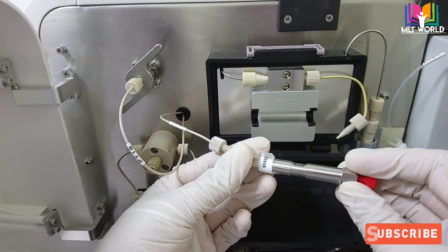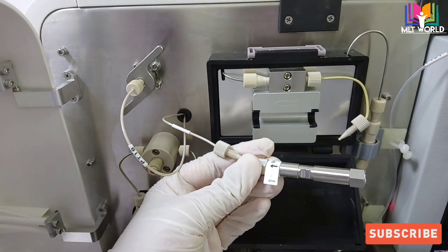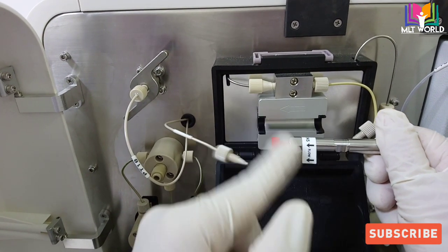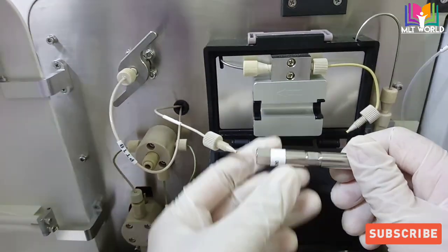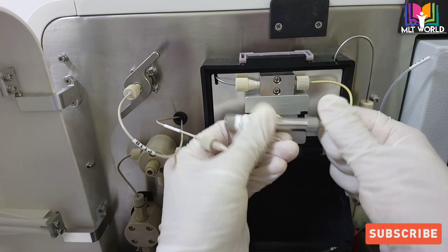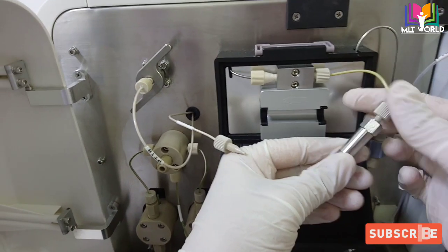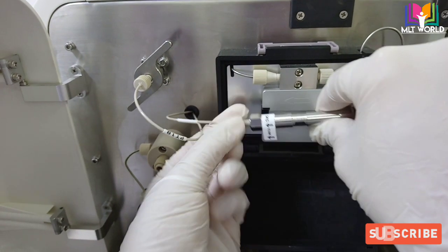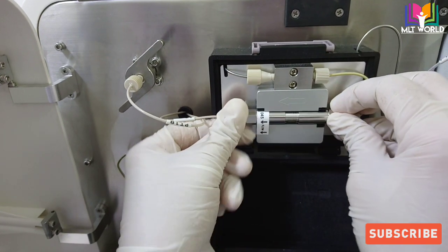We will take the new column. Remove the red lock caps and discard them. You can see the arrow direction on the column and the arrow direction on the machine screen — in that same direction we will place the column. Tighten it closely, then keep it back inside the column box in the correct direction and close the box lid tightly downward.